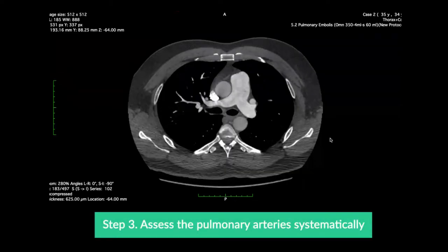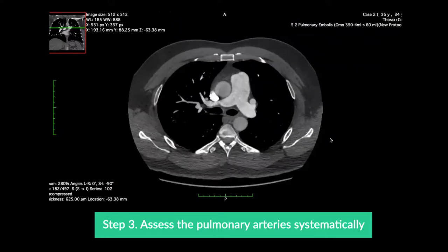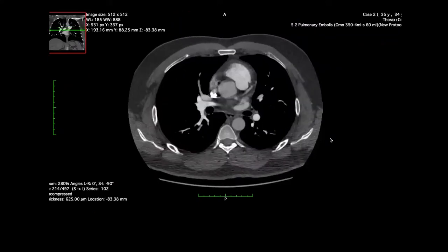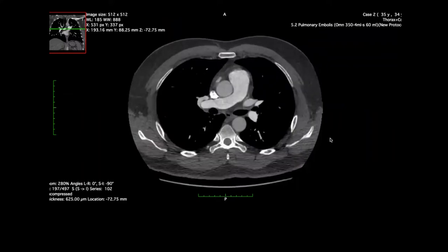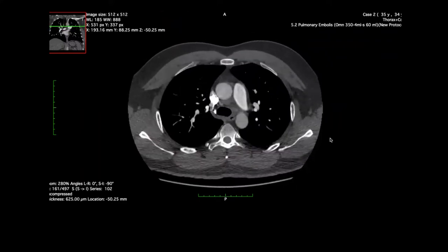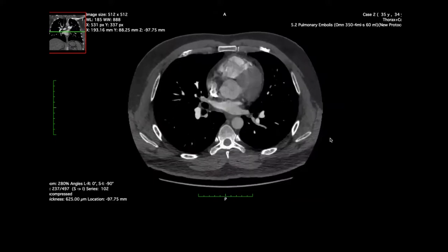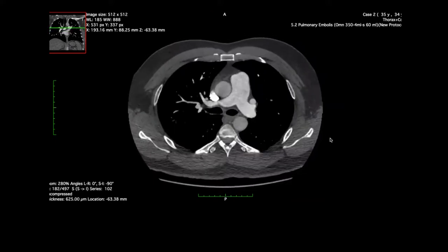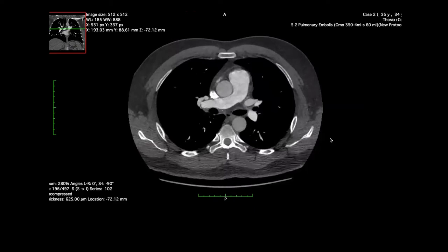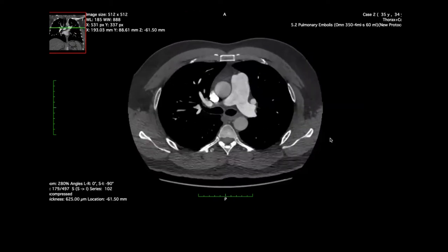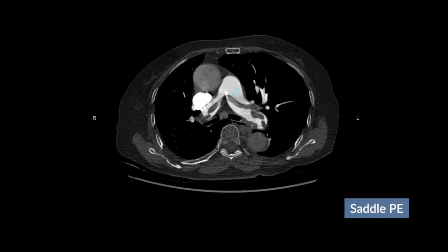Review the pulmonary arteries systematically, starting centrally from the main pulmonary artery. Scroll up and down and look at all slices which cover the main pulmonary artery, and look for any filling defects to suggest PE. Then move to the right and repeat for the right main pulmonary artery, and then the left main pulmonary artery. By doing this you can quickly exclude a major PE or a saddle PE.